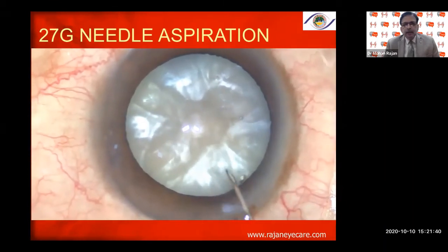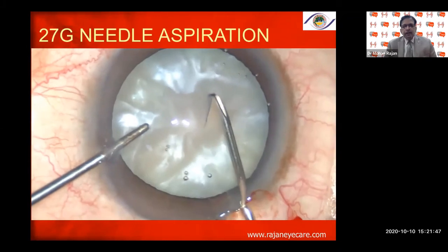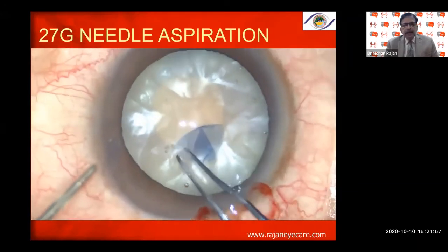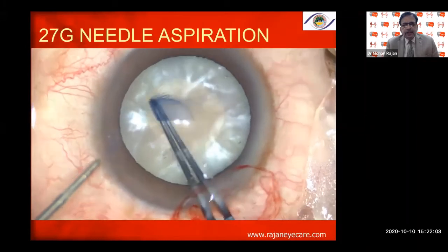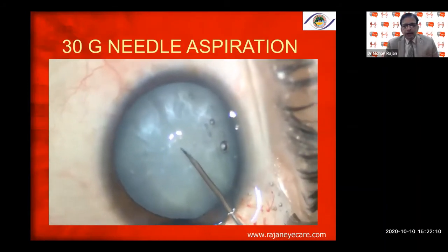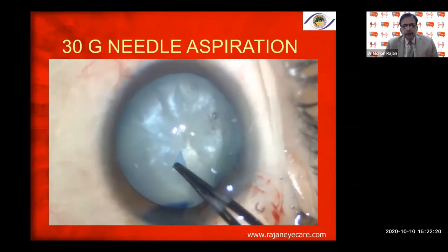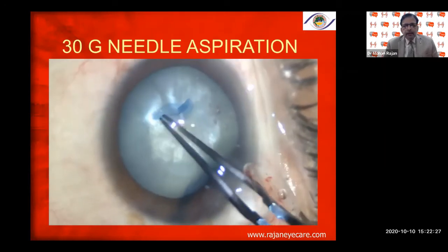You can use a 27-gauge needle to aspirate the liquid cortex by making a small opening into the anterior capsule. Once you reduce the intralenticular pressure, this takes care of the front compartment. Then proceed with capsular rhexis, staining with trypan blue, starting with the needle and completing with the capsular rhexis Utrata forceps, making sure the anterior chamber is deep for a good capsular rhexis without any problem.